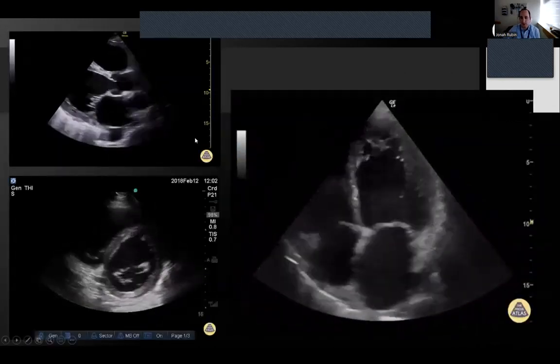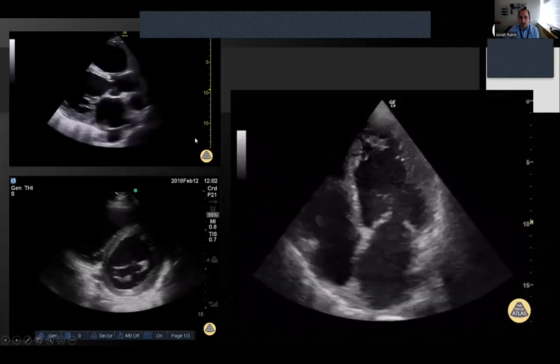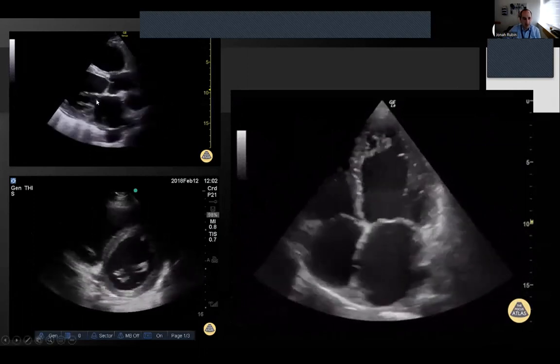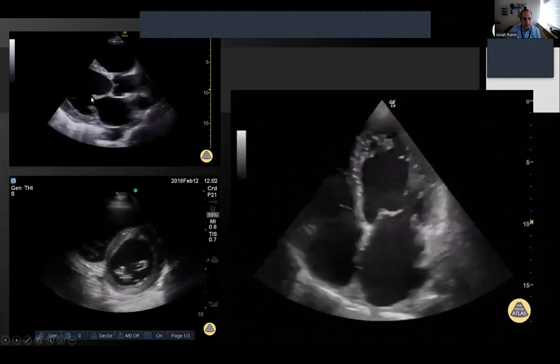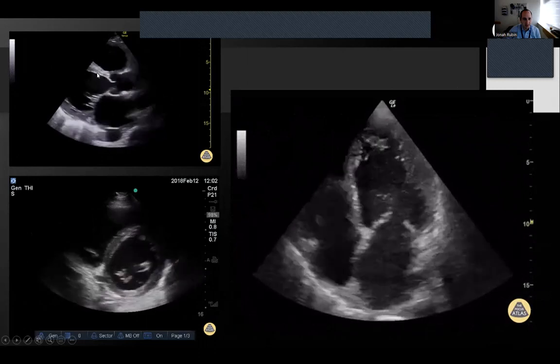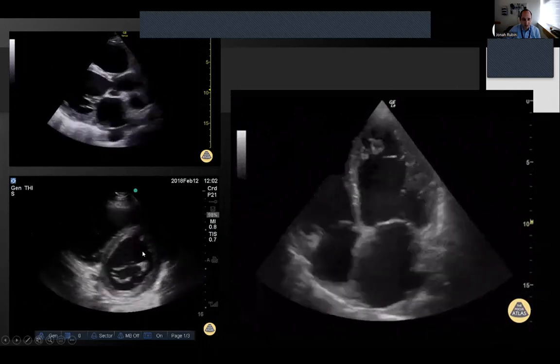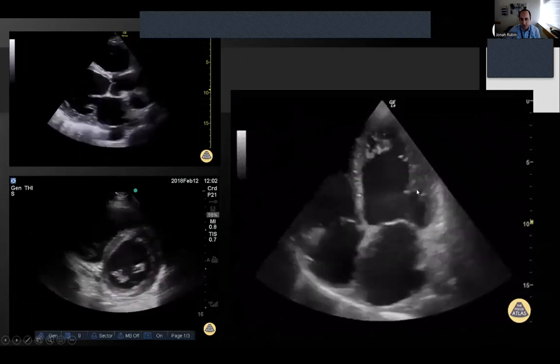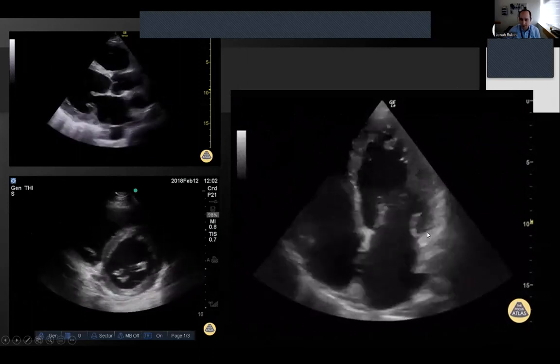So you probably don't need to be an echocardiographer to notice that this is bad, right? You're seeing almost nothing, no thickening here, barely moving anterior mitral valve leaflet here, certainly more than 7 millimeters. The fractional shortening is going to be terrible here. Same idea here, no thickening, no movement, barely any budging of the mitral valve.